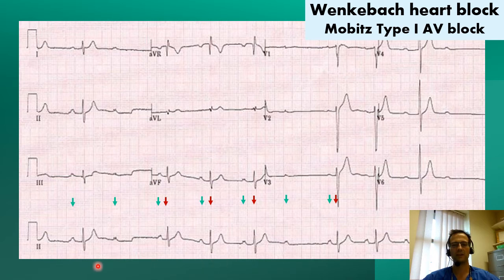But for an elderly patient, as a routine ECG done for a pre-surgical procedure or for whatever other reason, not done for anything specific, I would be concerned that we need to look further to see if there are higher degrees of heart block that require a pacemaker. So in itself it doesn't need it, but it should raise your suspicion depending upon the circumstances.